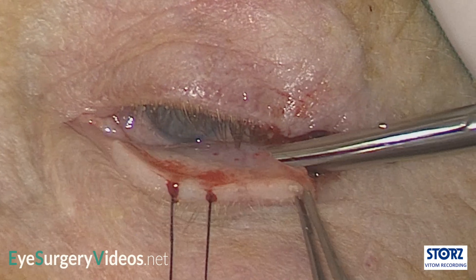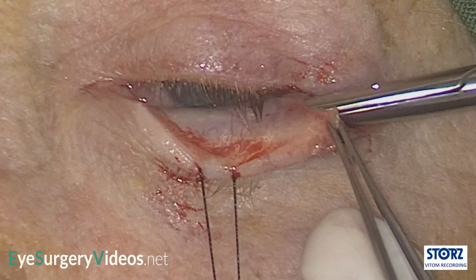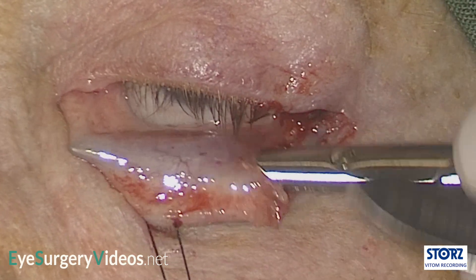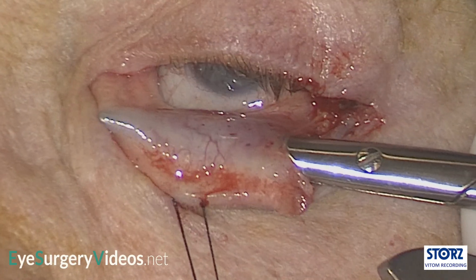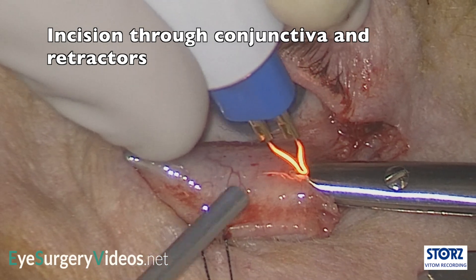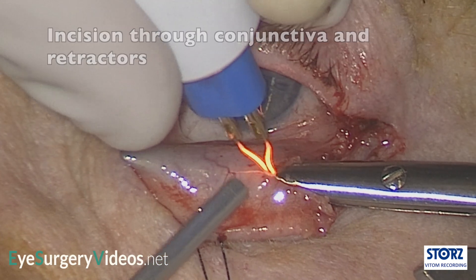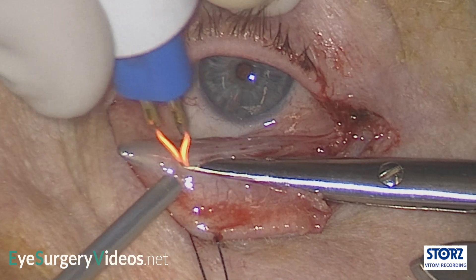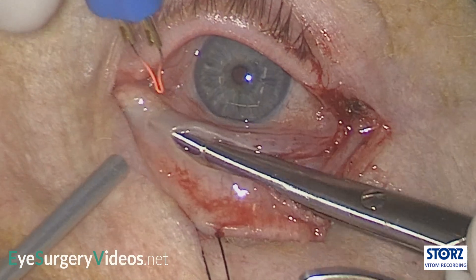The scissors should slide along this plane without impediment. The conjunctiva and lower lid retractors are incised a few millimetres inferior to the tarsal plate with a hot wire or cut with scissors. This incision can extend as far medially as required.